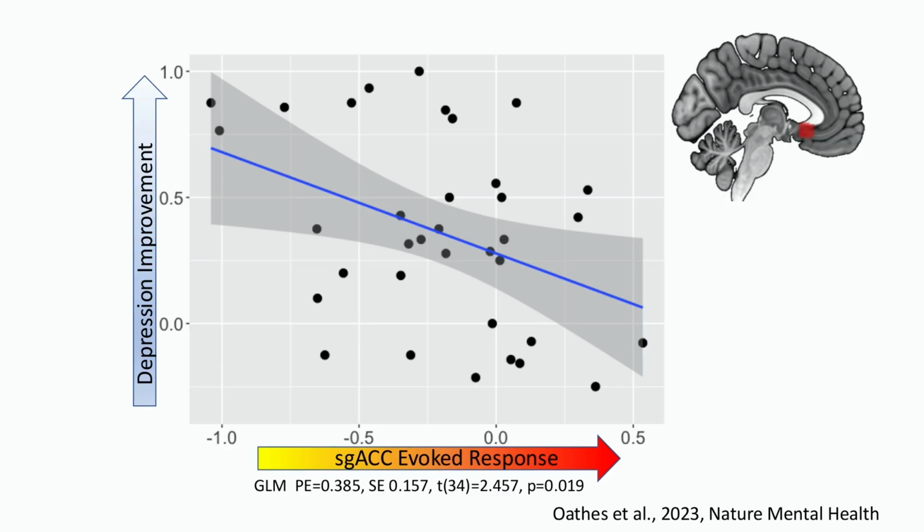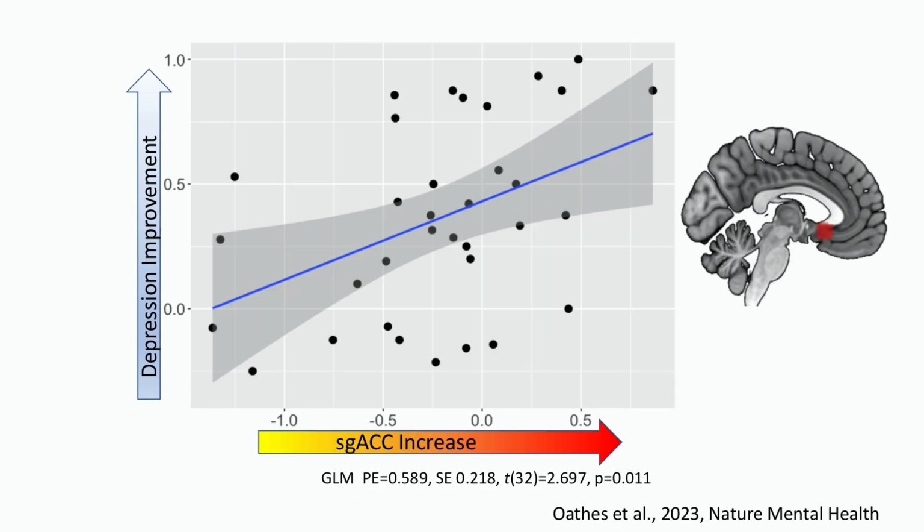So potentially, that means if you and I have different ways of processing our imaging data, we have different ways of suggesting putative targets for TMS, before we do the actual intervention or treatment, we could ping multiple nodes and say which one of those engages our target better. And that might be the best way to treat the patient. We don't have to wait for the clinical evidence to tell us that it didn't work. We can try engaging the circuit ahead of time and optimizing for the outcome we want, as long as you know what the brain target is that you're really chasing after.